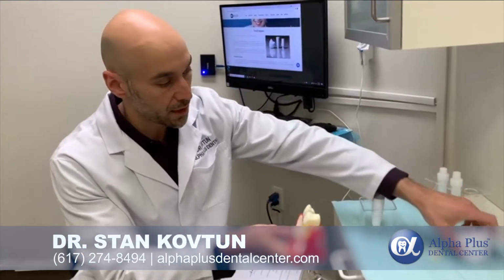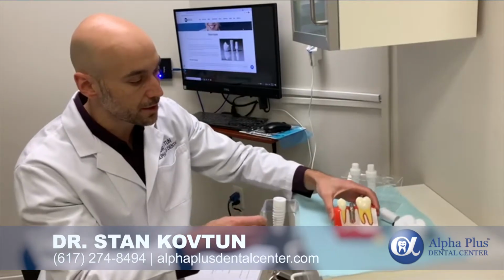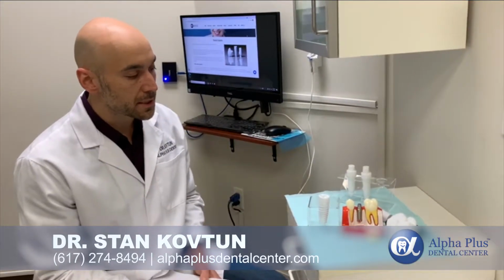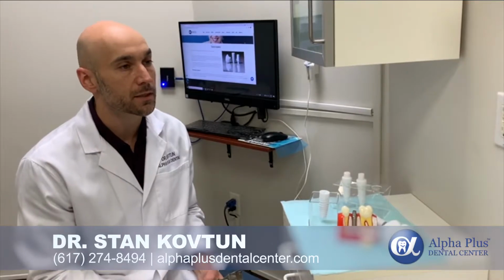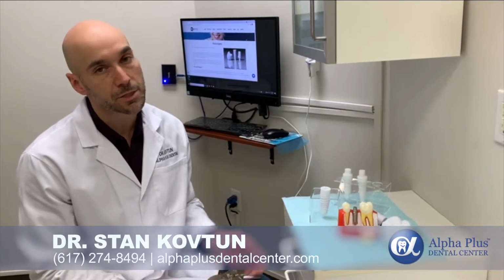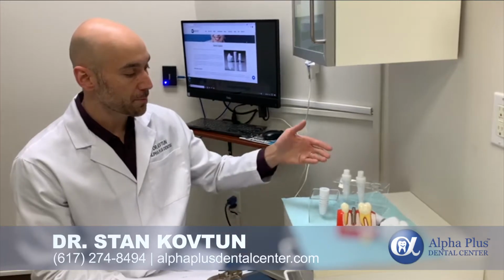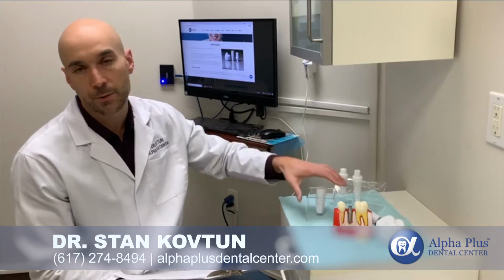Now, the difference between this implant that you see here and, say, these white implants is these are actually made of zirconia. So zirconia is a ceramic material. And what makes it a little bit different from titanium is that some of my patients come in knowing that they have an existing allergy to titanium. So some research shows that 2% of the population can develop an allergy to titanium, or of the population that's been tested, 2% of it does have an allergy to titanium. And so we place a ceramic implant, which is much more inert than titanium. It doesn't sort of interact with the body in any way.